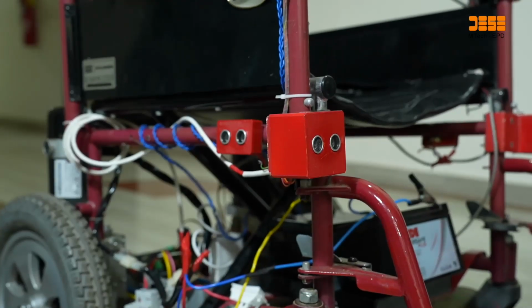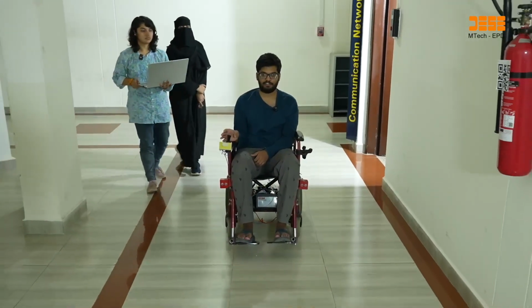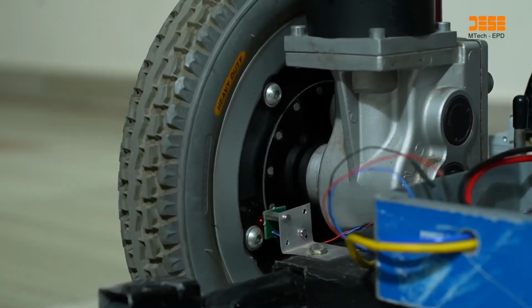We have implemented a PID controller in our system for the smooth motion and smooth braking, and also it ensures that both the wheels move in the same RPM. The PID controller also ensures that the wheelchair moves at the set RPM no matter what the weight of the person is. So as we mentioned before, we are using Raspberry Pi as our main controller for the project.